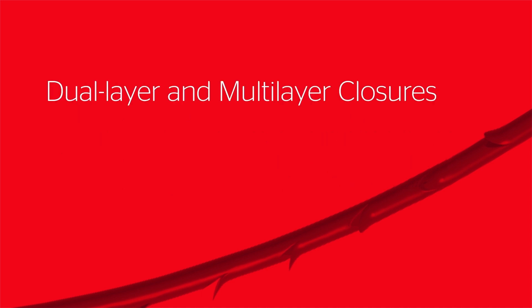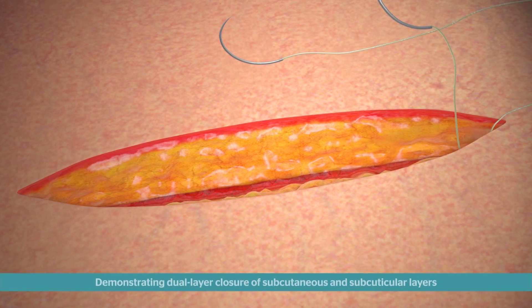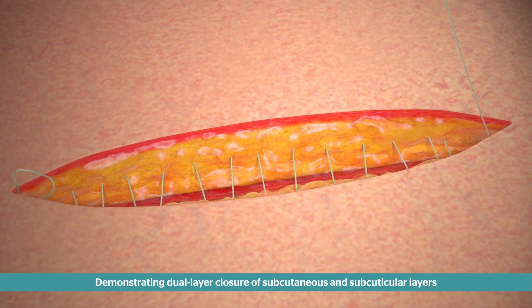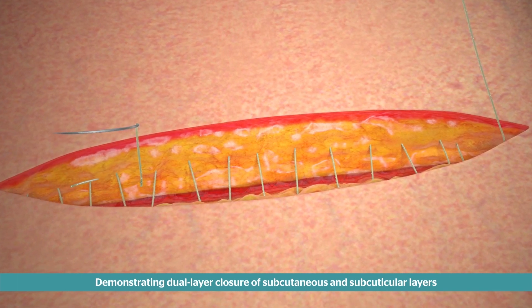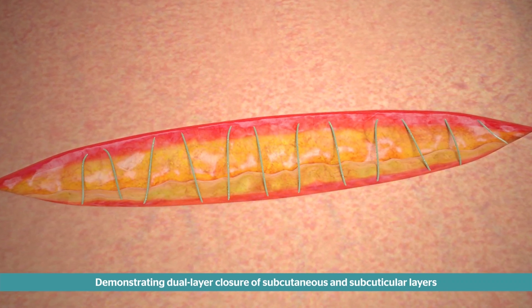Bidirectional Stratafix devices can also be used for dual and multi-layer closures. To perform a dual-layer closure, start at one end of the incision and pull the needle through the tissue until the transition point is reached. Use one needle to close the deeper layer and the other for the superficial layer.